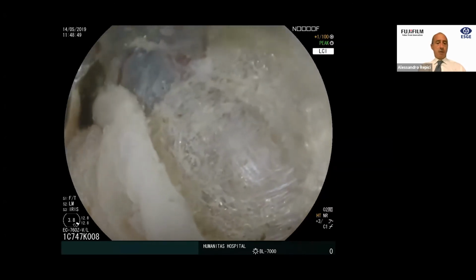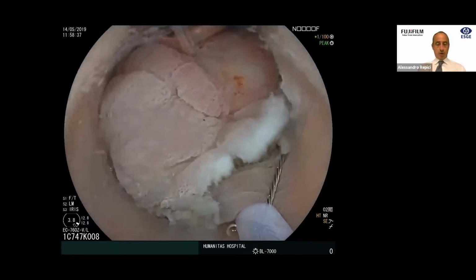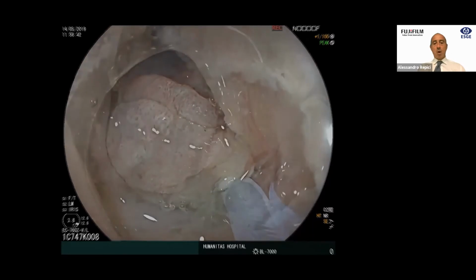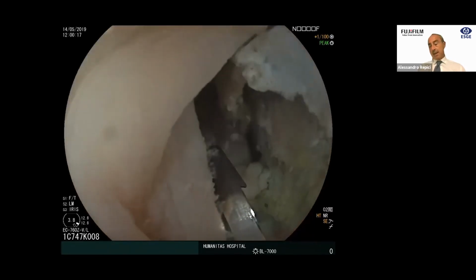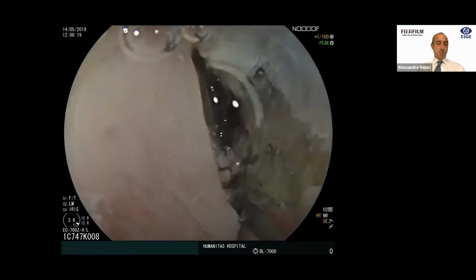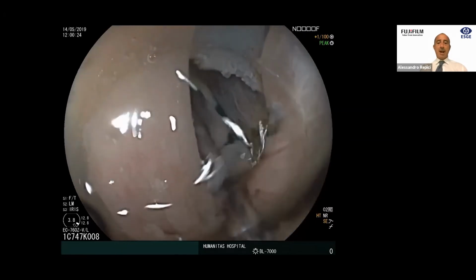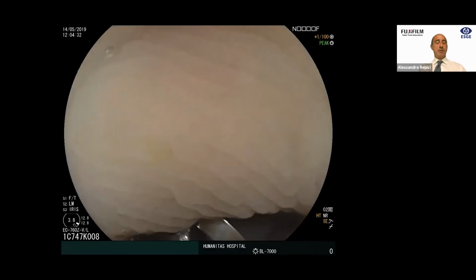There was a lot of fibrosis. So I used the combination of hybrid and underwater. I love the combination of hybrid and underwater because it allows you to go en bloc also for lesions as big as this one. And again, when I remove such big lesions en bloc, especially in the right colon, to avoid delayed bleeding, I remain underwater and apply clips to completely close the resected site.